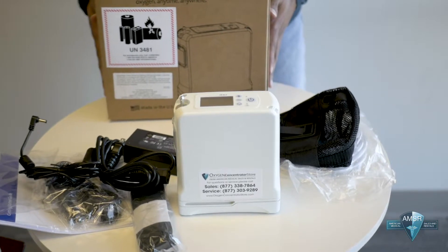That's pretty much everything that you will get in the unboxing. As you can see it's very simple and very easy. This is the Energen G4 concentrator.